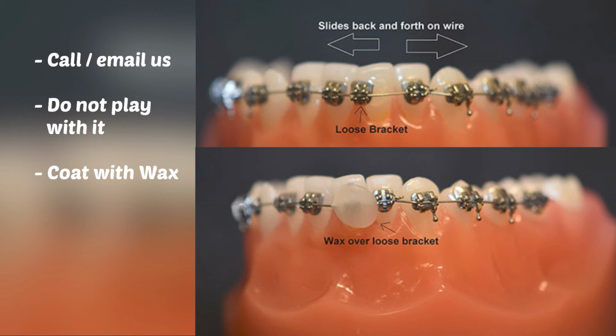If the bracket spun around on the wire and is scratching your cheek, use a pair of tweezers to spin it back, or put a piece of wax over it.